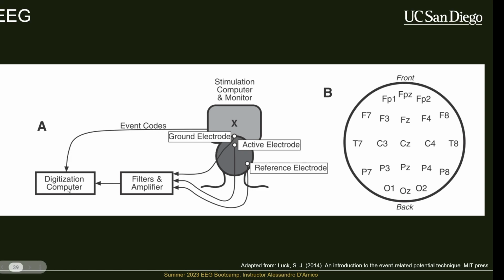And then we can essentially look at, okay, what does the activity look like when people are pressing X's versus pressing O's, or looking at X's versus looking at O's, or even what does it look like when somebody accidentally says they saw an X, but really they saw an O. You can only really start asking these questions when you have precise information about when they happen, and that's a big part of the research that I do and what we're going to be covering here.